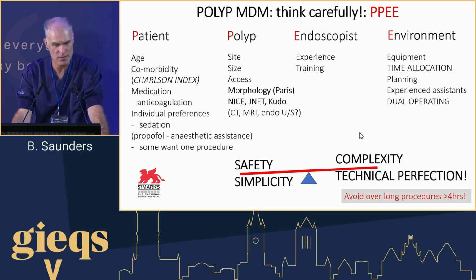I would also emphasize that safety and simplicity always trumps complexity and technical perfection. So we have to weigh up all of these things. We might have a very elderly comorbid patient who can have a 20-minute piecemeal EMR, which is a better procedure than a lengthy deep sedation ESD.